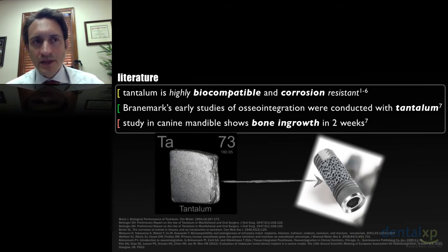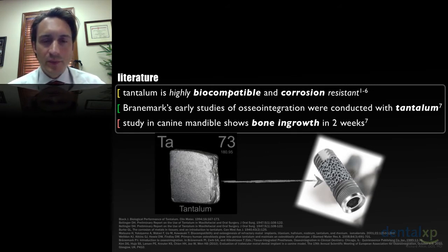And we have some studies that had been done in canine mandibles that show bone ingrowth into this trabeculation of tantalum, this application of tantalum, in about 2 weeks. So we know that the body likes tantalum as much as it likes titanium. And you can see on this slide a number of studies to support that.